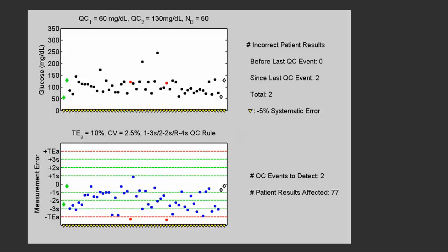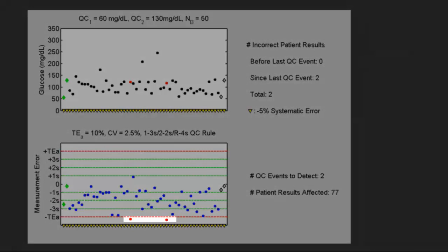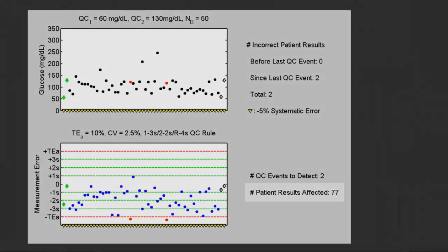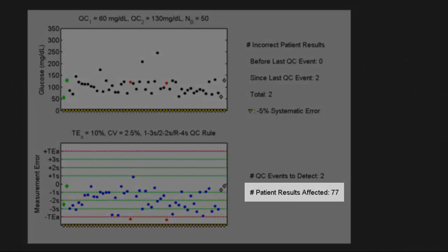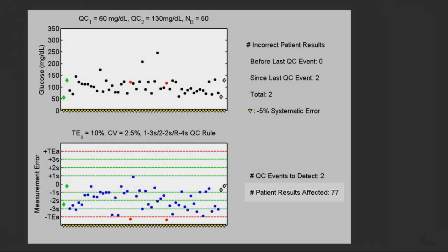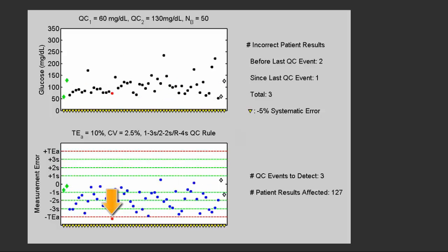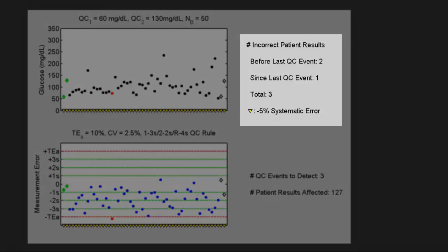Now we see two results that fail to meet the quality requirement. Note that all of the results are being affected by the five percent shift, but only two of the 77 results that have been affected failed to meet the quality requirement of plus or minus 10 percent measurement error. If you look at the actual glucose levels for the two points that failed to meet the quality requirement, there is no indication that those points are not fit for their intended use.